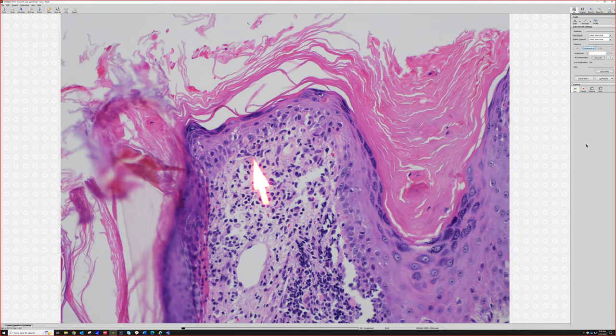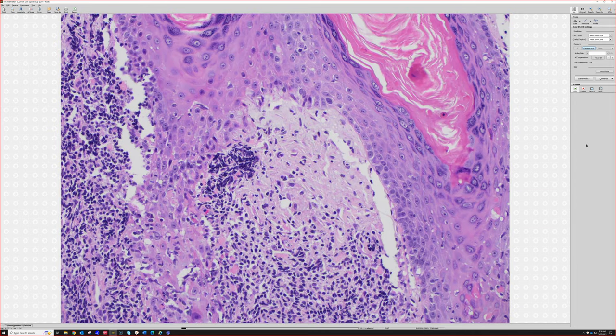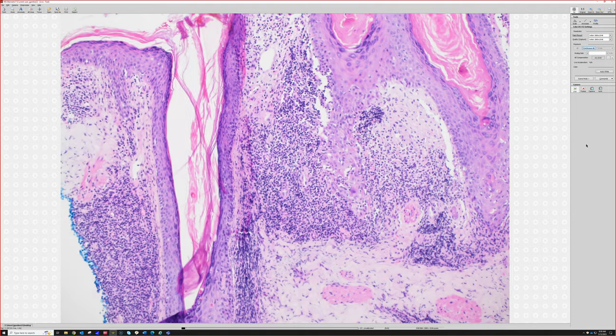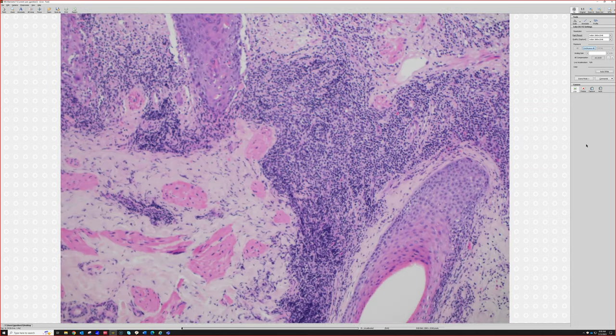There's dying keratinocytes there. And it may have either totally absent, burnt out inflammation with zones of thick basement membrane and scar, or it may be thick and lichenoid. It can run a range, okay? And then the dilated follicles plugged with keratin. So that's great. Discoid lupus. Very good. And of course, it's got to fit clinically too.